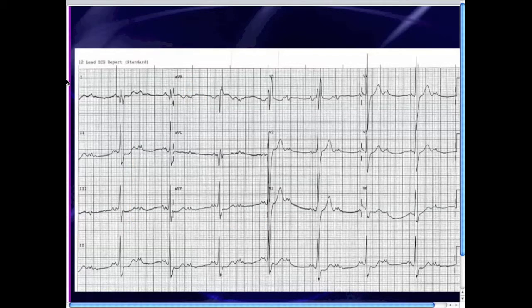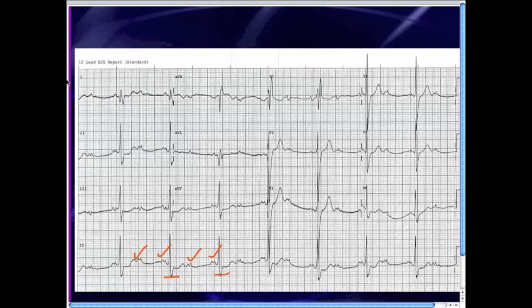If you take a close look at those atrial beats, they're going at a rate of probably about 90 or so, so we can call this a sinus rhythm. You also notice that there are two P waves for every one QRS — two P waves for every one QRS — and that pattern repeats. Since there are P waves that are not being conducted, this must be some type of AV block.